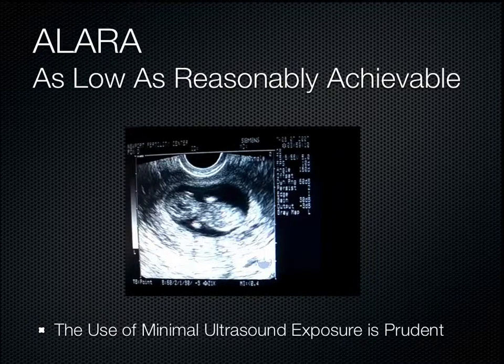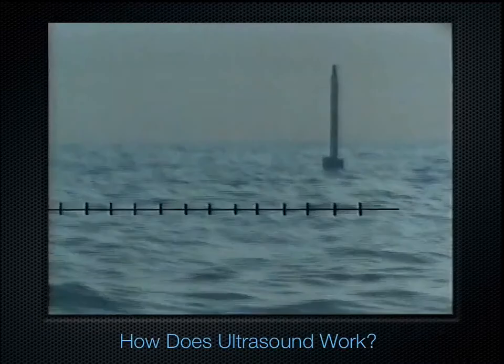The world's literature has not shown any epidemiological evidence of fetal abnormalities in humans from ultrasound exposure, and that's going back over 40 years now. So the next question I have for you is, how does ultrasound actually work? And let's ask our friend Sean Connery.